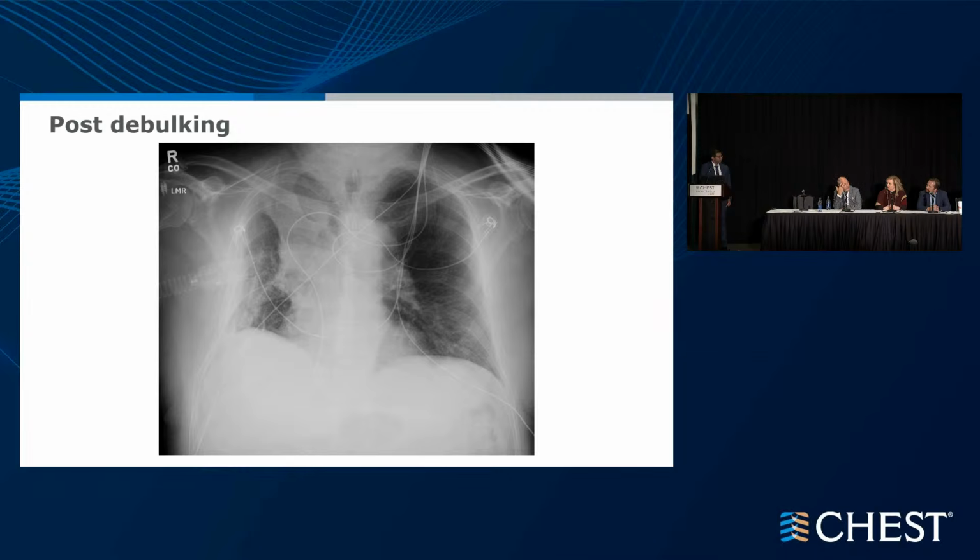So I don't know. It's the time of COVID. He lost follow-up already. You don't know if they're going to come back again and when they're going to come back. If this was truly during the pandemic, 2020 or 21, I would have probably stented him. Today, I think I would have done exactly that. Maybe just clean up a little more, sure, and then bring them for a close follow-up.